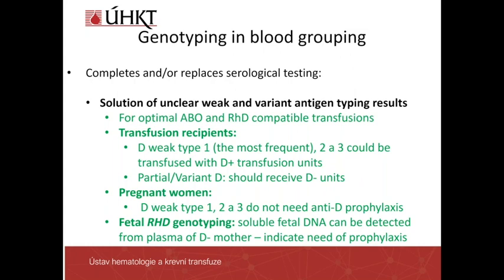And furthermore, we can also look for a fetal genotype from maternal plasma by non-invasive techniques. We can detect fetal DNA in maternal plasma, and we can indicate the need of prophylaxis in D negative mothers carrying a D positive child.